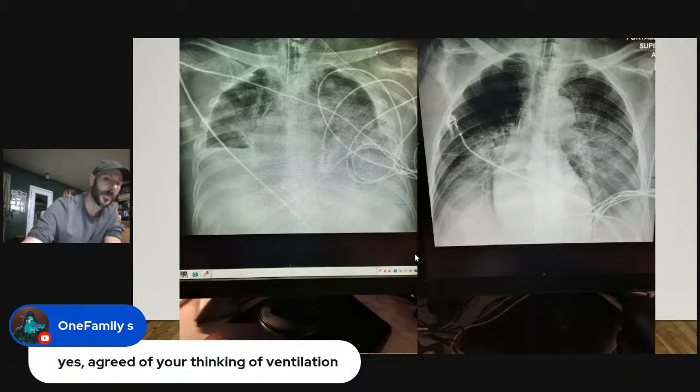But these are cases where the P high is beyond 30. Sometimes people don't do their mechanics, and then you look and everyone's freaking out because I put a P high that's been adjusted with electrical impedance tomography too high, but then I notice sometimes plateau pressures might not be measured and they're very high.